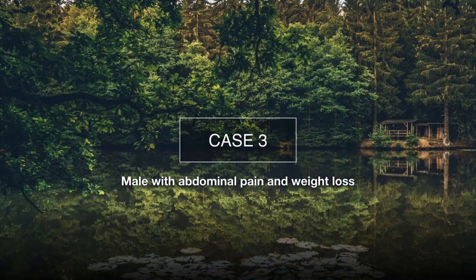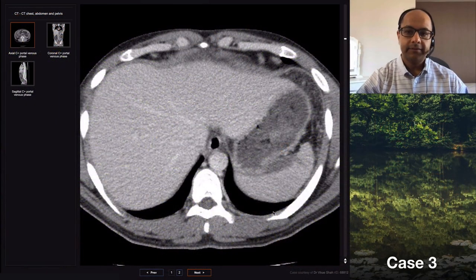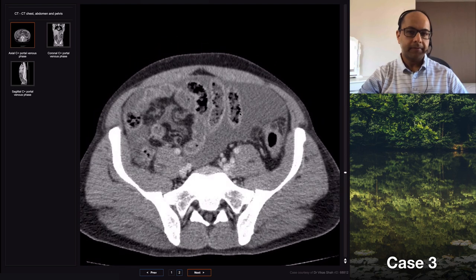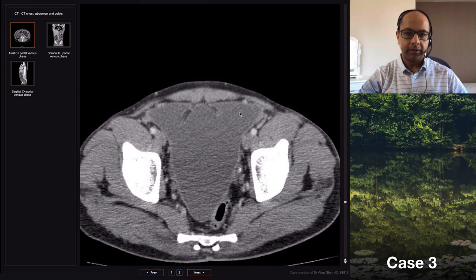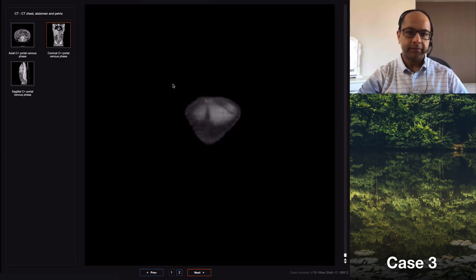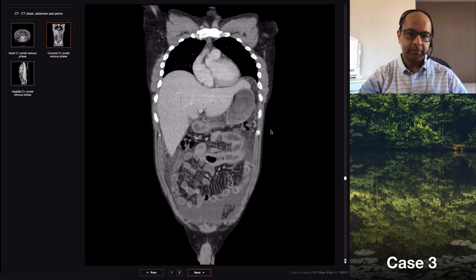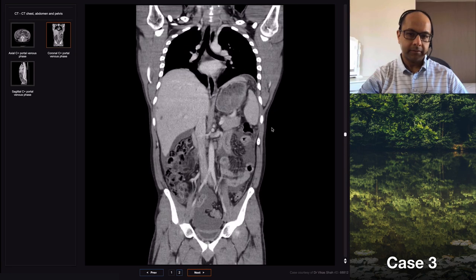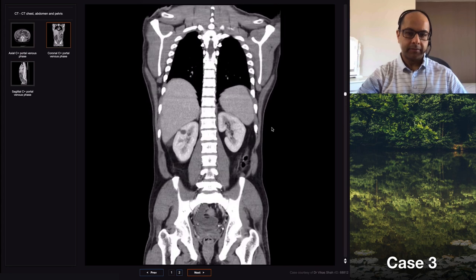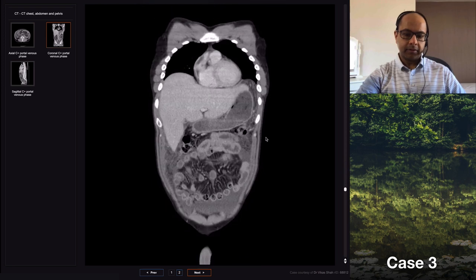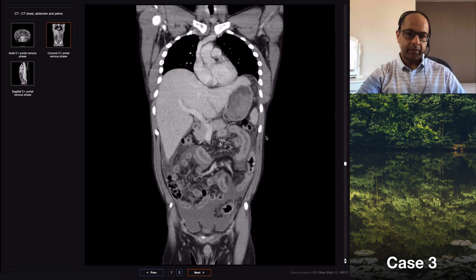Case number three is a young man who has abdominal pain and weight loss. On CT there is gross ascites. The bowel loops appear abnormal, likely due to underlying peritoneal reaction. There's no bowel wall thickening or bowel lesion as such. There is peritoneal enhancement, and in the coronal sections I can barely make out some lymph nodes in the subcarinal region.